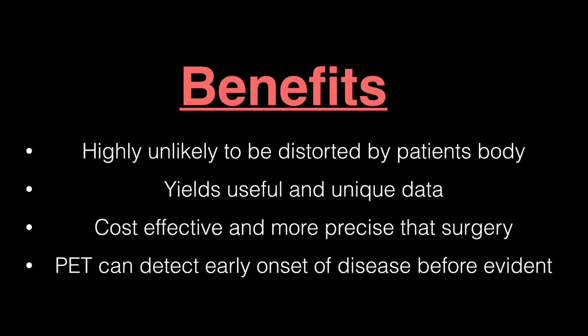And it is through the use of nuclear medicine scanning techniques that it yields useful and unique data enabling diagnosis and appropriate treatment plans without the use of surgery. As well as this, PET scans are cost-effective and may detect disease before it's even evident in other tests.